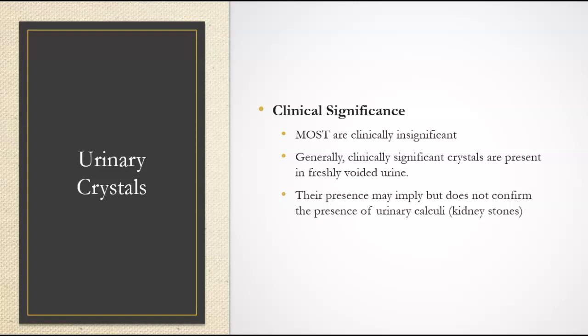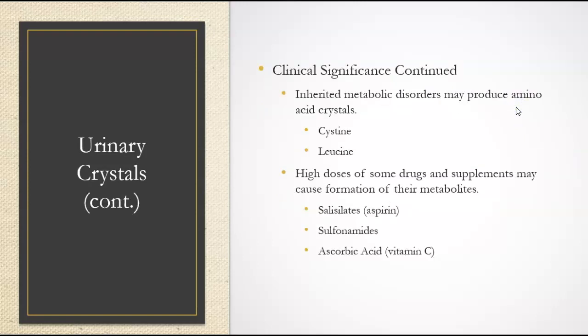So for class purposes, when we're getting donated urine, which is a challenge this semester, if I donate urine or our lab instructor donates urine, we can see crystals form just from it sitting in the refrigerator waiting for your lab to begin the next day. So it doesn't necessarily imply that you have a kidney stone. It doesn't confirm any of that, but you could potentially see kidney stones in the future if you have a large amount of these crystals present.